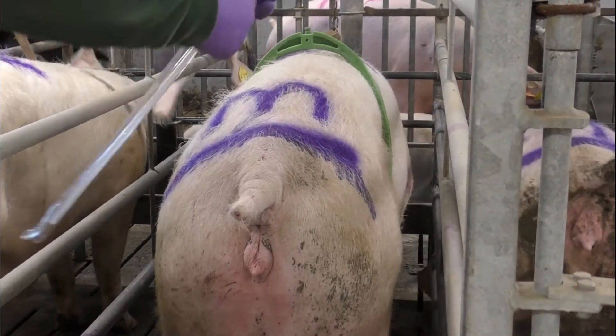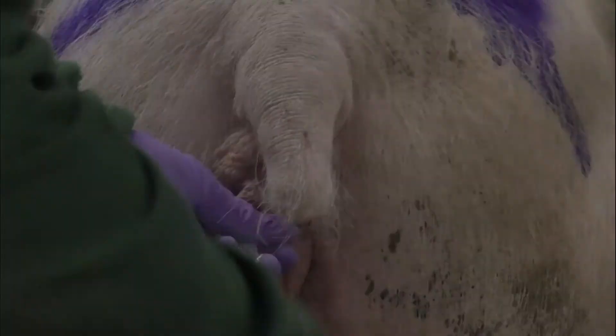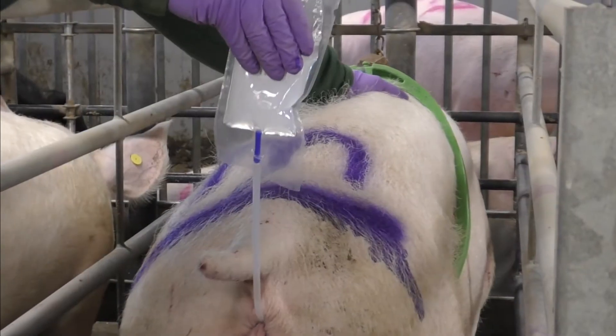Insert the catheter gently at an upward angle into the vagina using gentle pressure and anti-clockwise twisting action until it is firmly locked in the cervix.